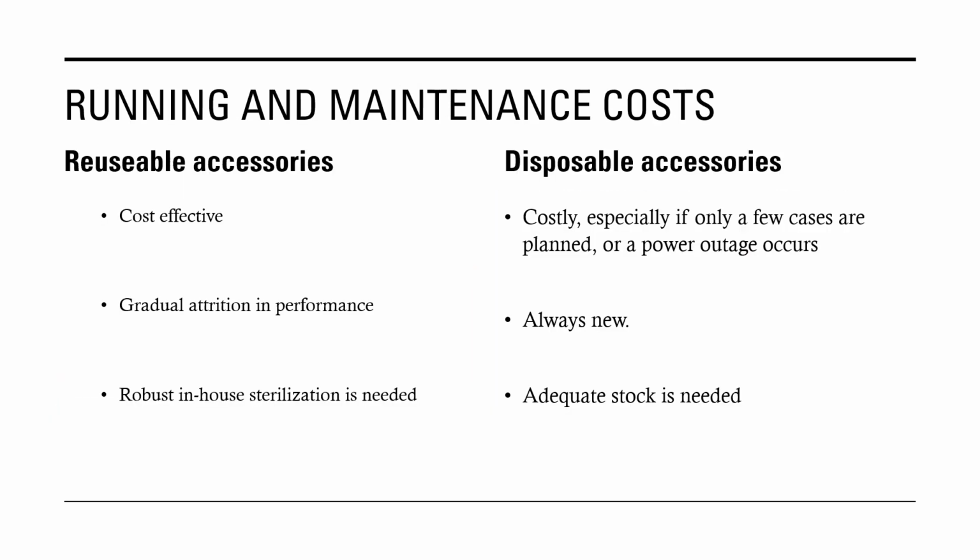Running and maintenance costs. Now there are options of reusable accessories and disposable accessories, and they have both some advantages and disadvantages.